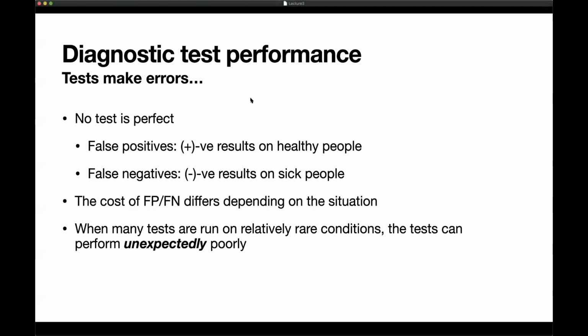But what I do want to show you is some very basic understanding of diagnostic test performance. And hopefully, if you didn't know anything about molecular tests, now you have enough understanding to stop and think that any of the number of steps there can fail. RNA can fail to amplify, probes or primers may fail to bind. Alternatively, you can have non-specific binding and a false positive. So the tests are not perfect. They will make errors. Hopefully not a whole lot of errors, but they will make some errors.